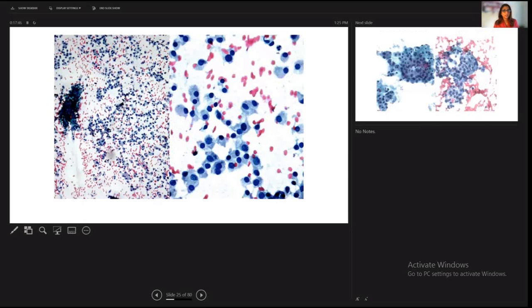And this is the Pap smear, again, showing a lot of cellularity. And for a follicular neoplasm category, cellularity is an absolute must. If you don't see an aspirate that's cellular, please don't even try going towards that category. Lack of cellularity should definitely sway you away from using this category. So cellularity and scant or absent colloid are two features that I use to really bump it up to follicular neoplasm or something beyond that.